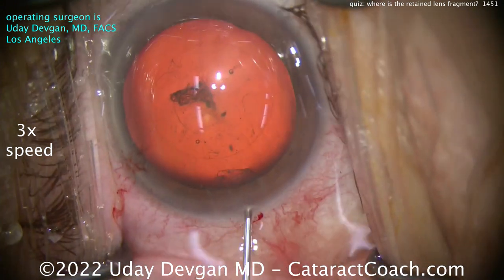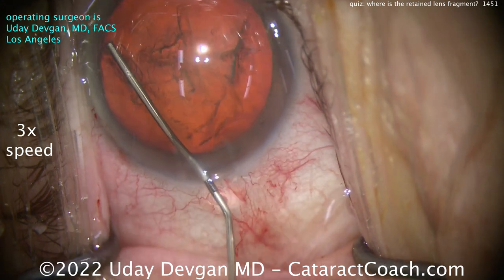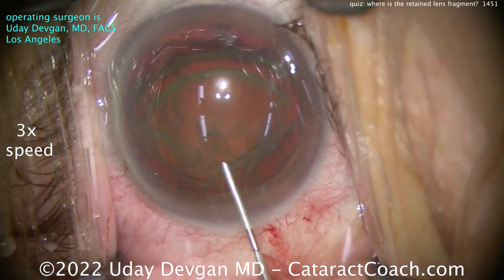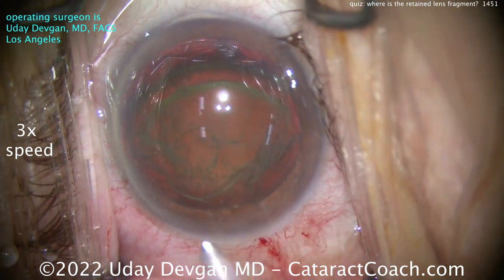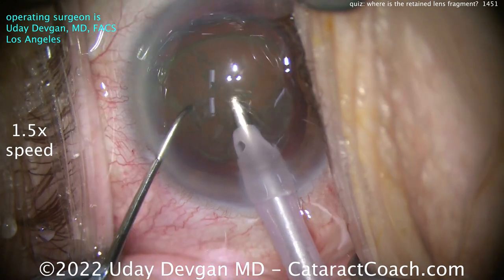That looks pretty reasonable. Again, this is shown at three times normal speed so you can see the entire case — it's a totally routine case, nothing unusual. Flip the nucleus up a little bit, not too dense, relatively soft actually. Let's put the phaco probe in and slow it down to one-and-a-half speed.